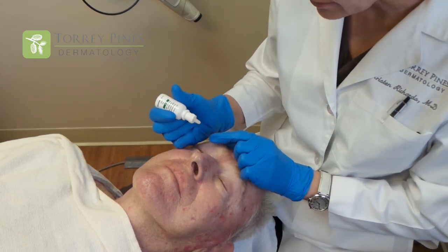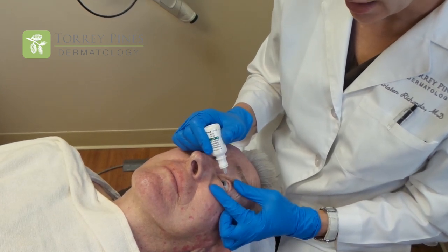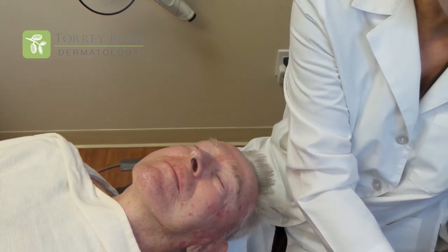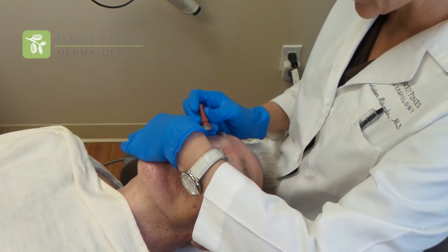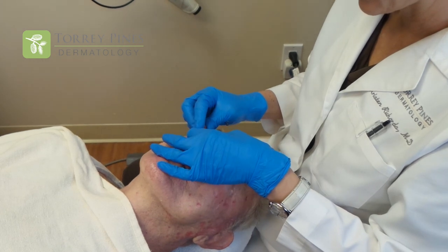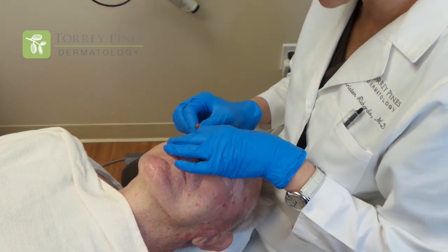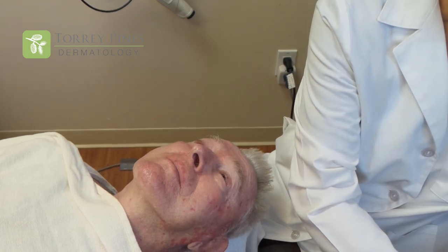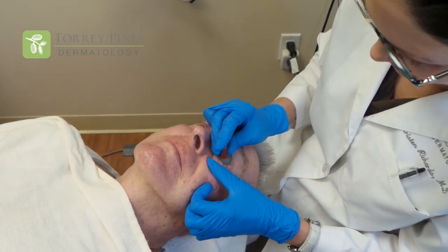We apply a numbing drop to the eye so that the eye shields slip in really nicely. We have the patient open their eyes and look way up over their head, then carefully slip the eye shield right in. We do the same thing on the other side, slipping the little eye shield in, and then we're ready to get started.